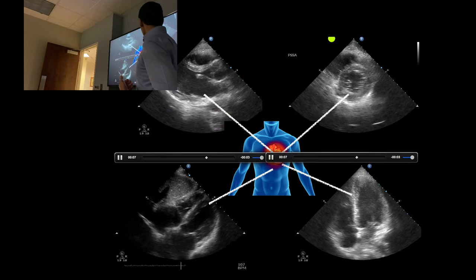This is the subxiphoid view — probe here. With cardiac ultrasound, the cardiologist convention puts the marker on the opposite side. So when you're in cardiac mode doing subxiphoid, your probe marker goes towards the patient's left. When the marker is on the other side, you just flip the probe. In this subxiphoid view: right side of the heart is here with the liver, and the left side is over here — a good global view.